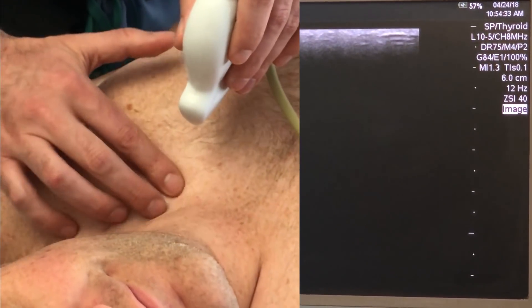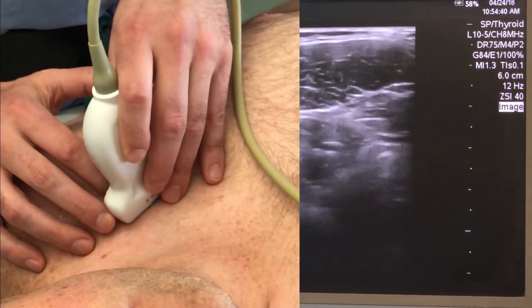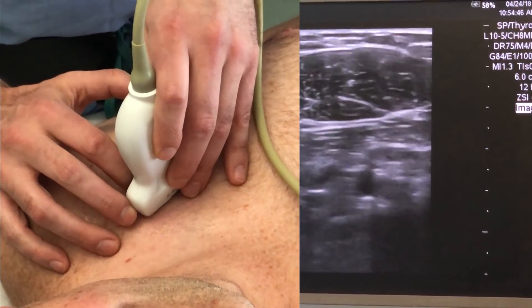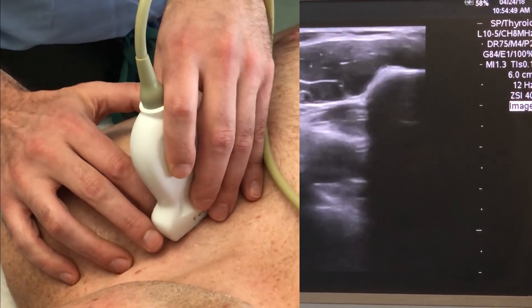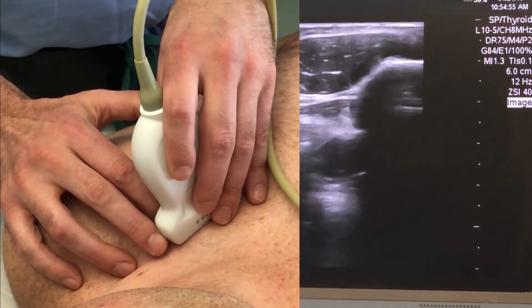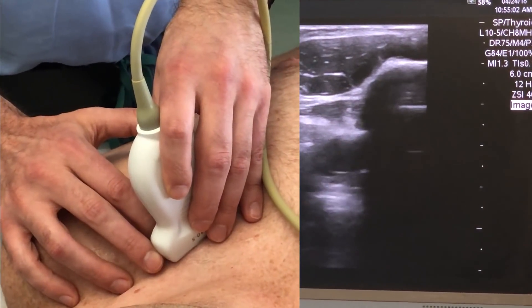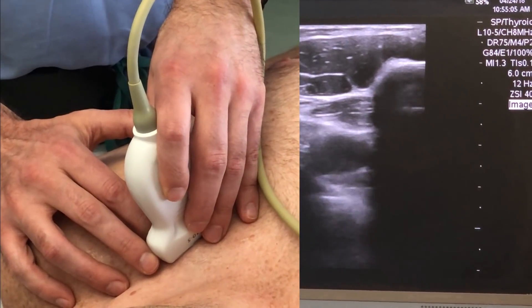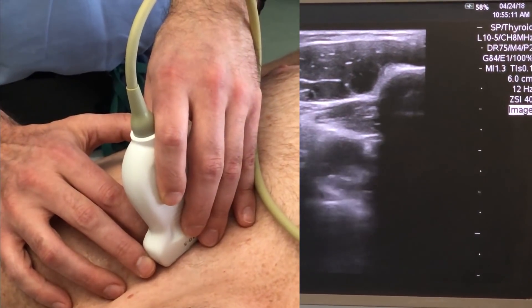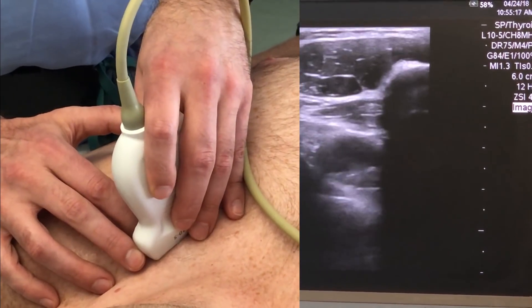Now Ryan's going to shrug his left shoulder up super high. We'll take another look here. Backtracking — that's the vein there. You've got to hydrate more when you're on call. So that's the vein there, and this I would think is a pretty reasonable shot. One nice thing — you can see the valve of the vein right there, which is always a beautiful thing when you see that. You know you're not going to go into an artery. And if we look behind the vein, we get the sense that there's a bright line there with nothing really moving. So now we've displaced the clavicle upwards and we have a shot of the subclavian vein with bone behind it. This is a pretty reasonably big target.